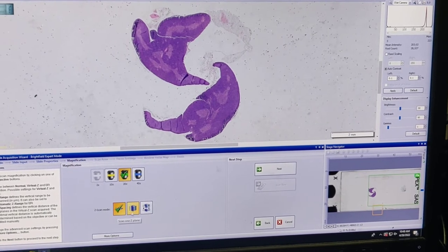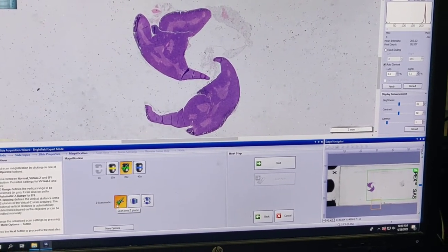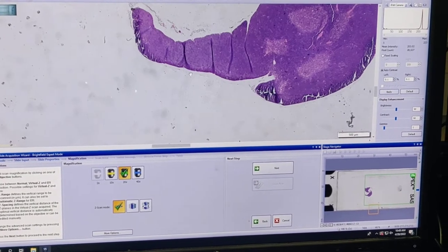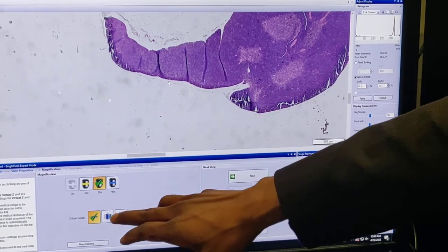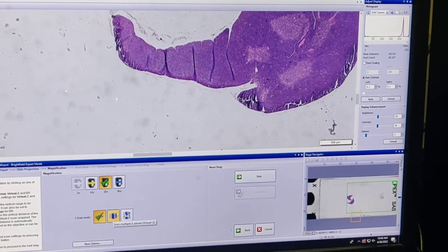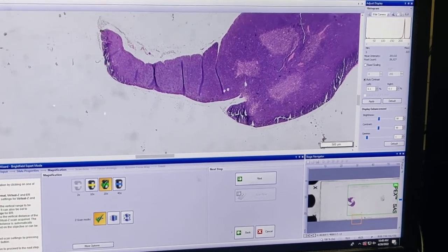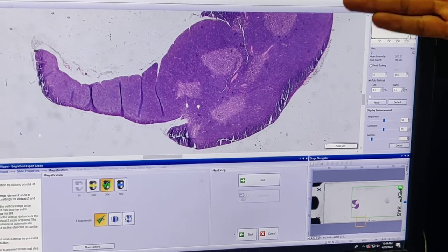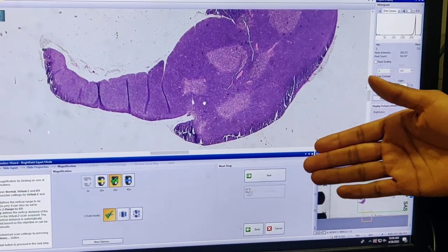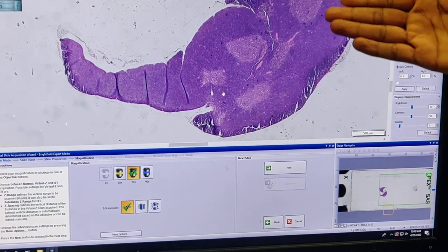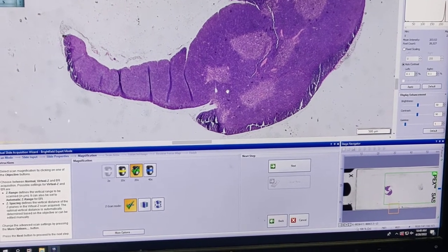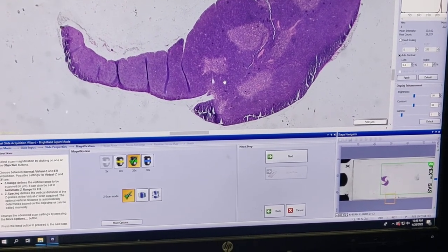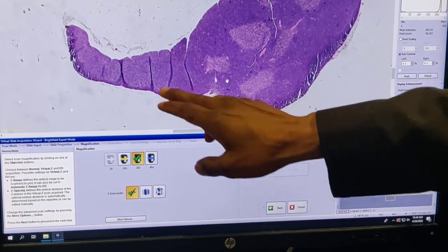There are different kinds of Z scans that one can do. For most samples, one plane is enough. But sometimes, as you can see, these are folded areas. That means there might be more than one plane. So some people like to capture images specifically for that. But in most cases not required, because confocal microscope is much better suited for taking the Z-stacks. This is epifluorescence microscope, so even if you take the Z-stacks, you will not be able to capture much difference between different planes because all the out of focus light is coming.